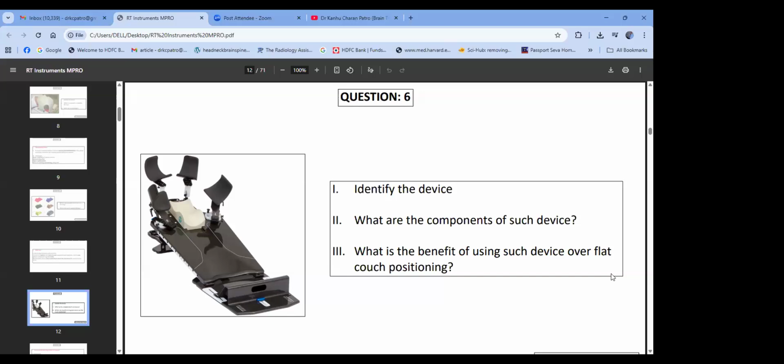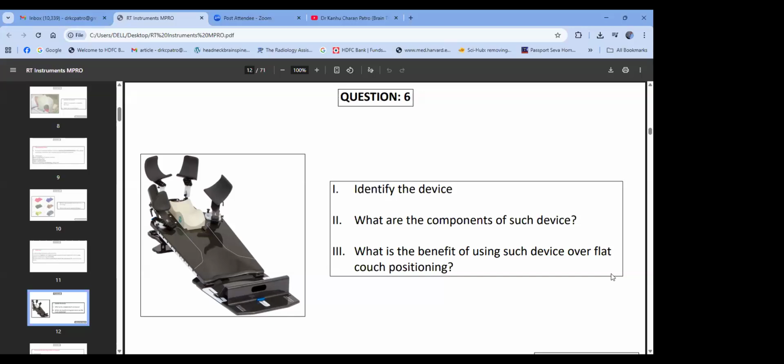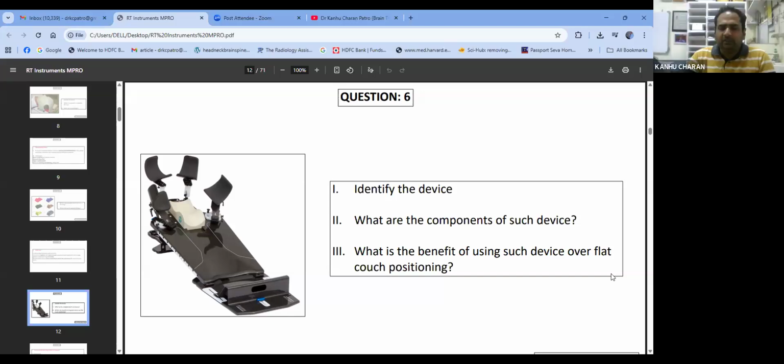Superior vena cava obstruction. Exactly. So in superior vena cava obstruction, this can be brought to use. Lying down will increase the difficulty. A few hospitals, very few hospitals, have something called an SVCO chair, where the patient will be in a sitting position and they'll plan 2D radiotherapy. But the breastboard can be used to give that angulation for the patient's comfort.